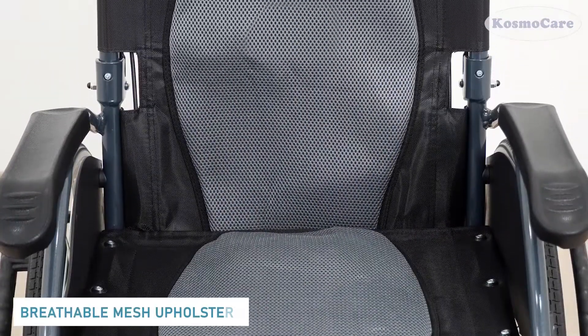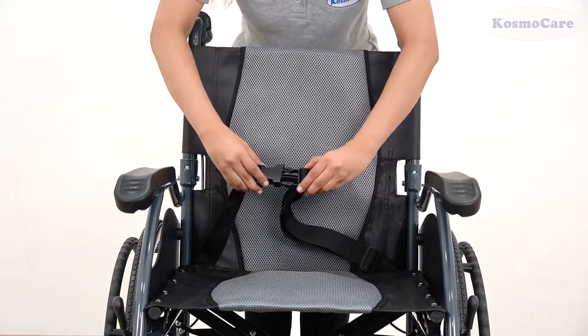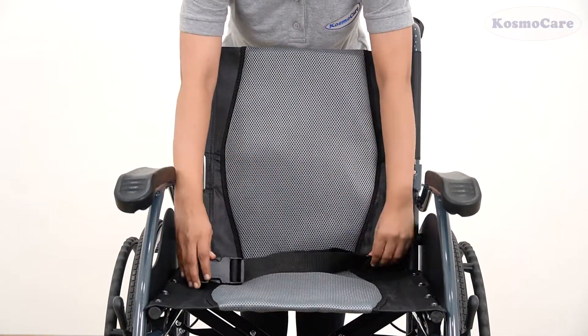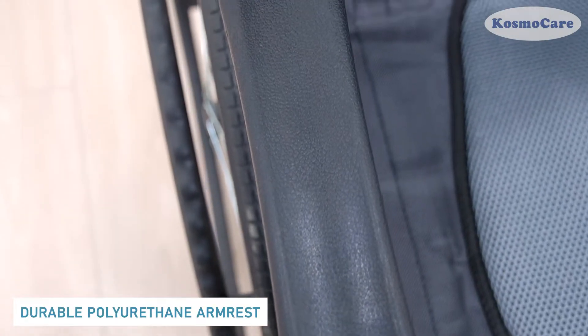The seat is upholstered in a comfortable mesh fabric that is water-resistant and breathable, and the built-in seat belt enhances user safety. Waterproof PU arm pads are extremely durable.